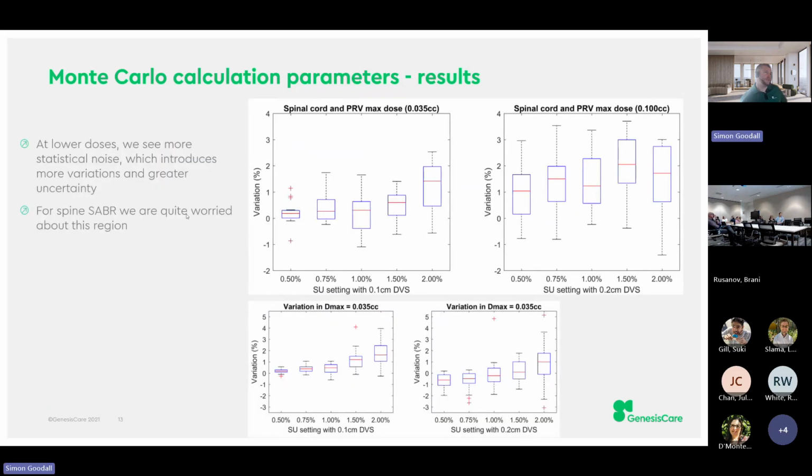And what we can see here is that, as we would expect, the spinal cord doses become a more prevalent consideration. So I've kept this as the same image from the last time. We can see there's relatively small changes. We see a much broader change, a much broader bar chart, for these in the lower doses, because inherently the statistical uncertainty there is higher because of the lower number of histories that pass through that region. So it just means we need to add a bit more consideration, or a bit more uncertainty, into the calculation of our OAR doses.